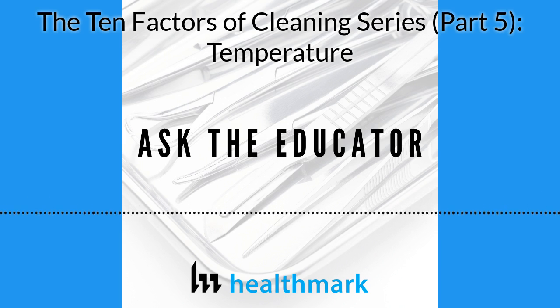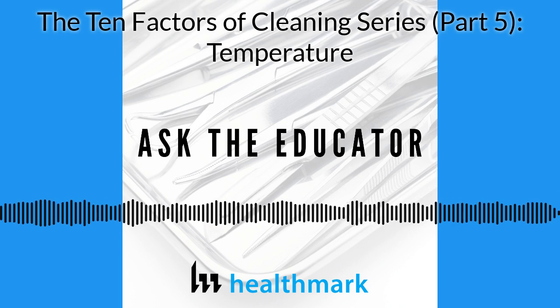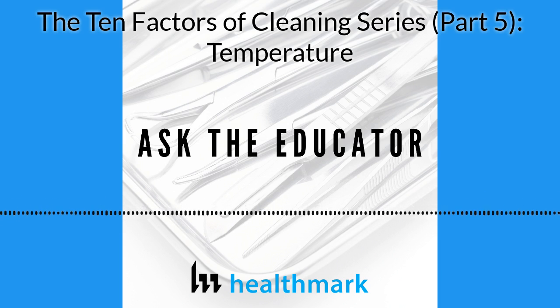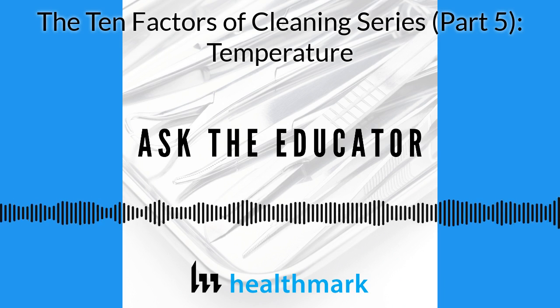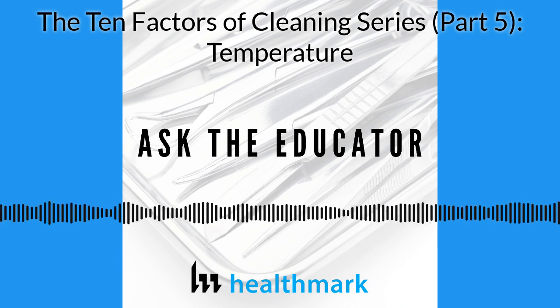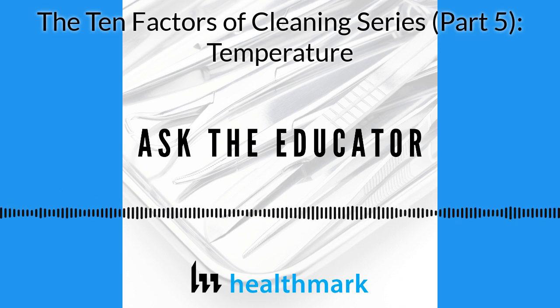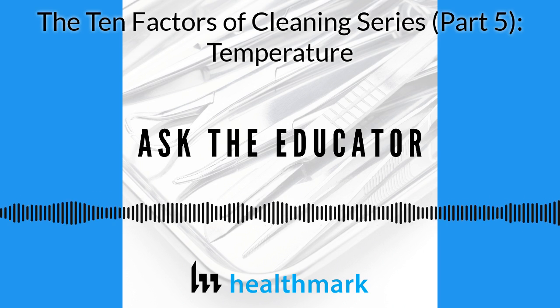And I know for us in the US, we have Joint Commission and other auditing organizations, and they do audit temperature. And if you look at, we've touched on IFUs, if you look at the medical device manufacturers, they support monitoring temperature because it's an important part of many of their products. And when it comes to cleaning chemistry, there's optimal temperature. So monitoring provides you feedback if issues occur to help you resolve that issue, specifically dirty instruments.